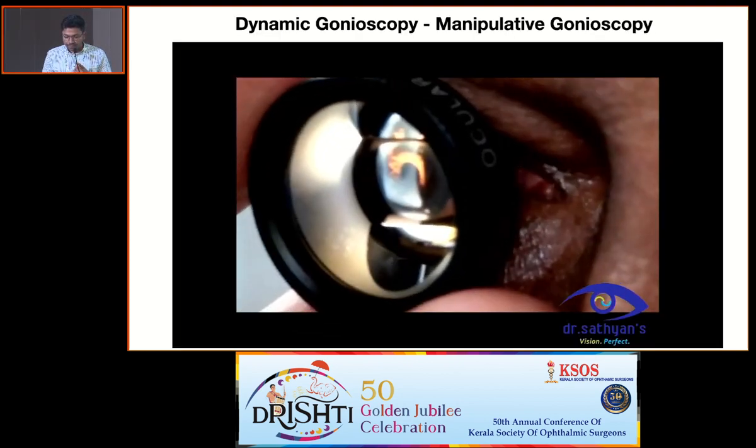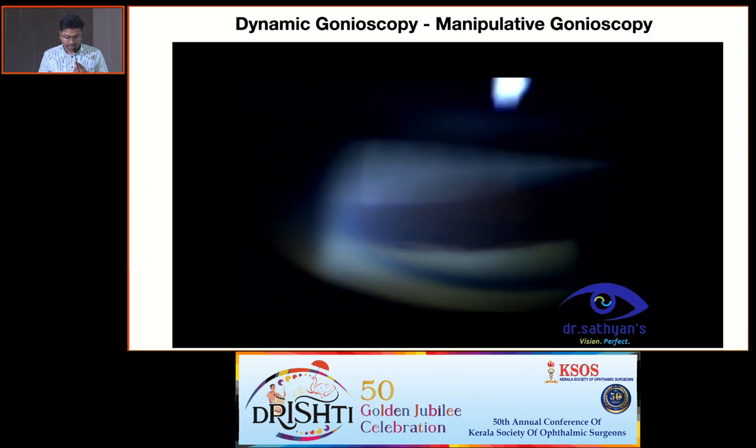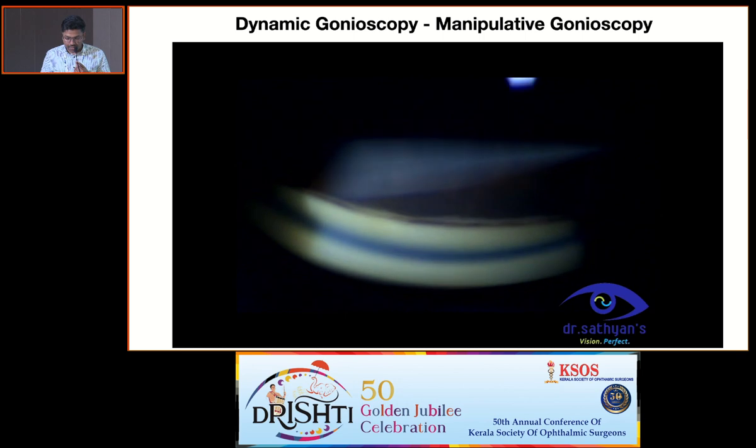This is a very nice video. The patient is positioned straight. We are seeing the patient is asked to look straight. Now you can see there is a positional closure. When the patient is looking down, you can visualize the angle structures which are opening.